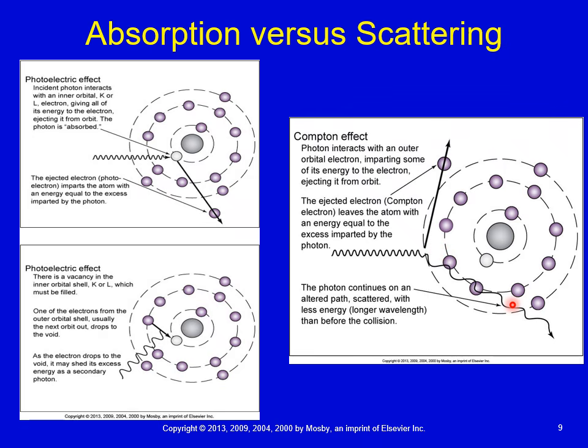Now, the scatter photon can travel in any direction, including traveling and interacting with our image receptor. All right, if it does hit our image receptor, then it does have the ability to affect the image quality in terms of the contrast of the image.